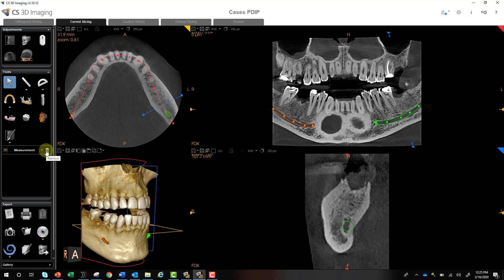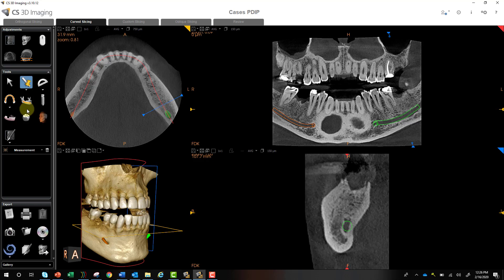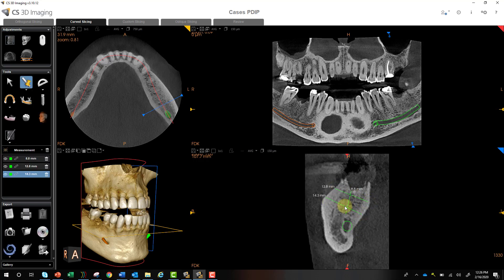That's one way to do it. Another way: if you hit the little drop-down triangle, you can select multi-measurement, and now you can take as many measurements as you want without having to go back and forth to your ruler. When you're done, notice you're still on the measurement tool — just change it back to your selection tool.